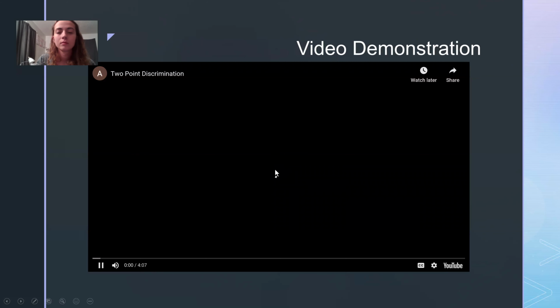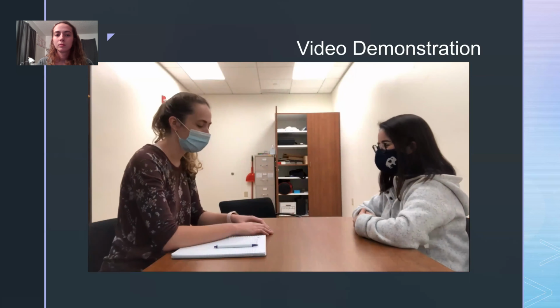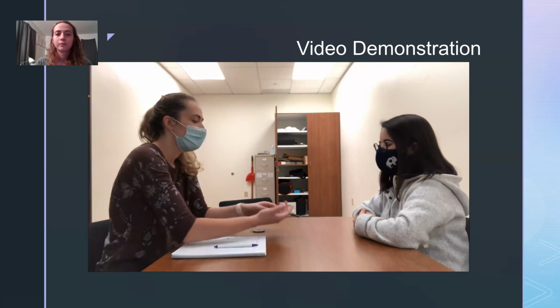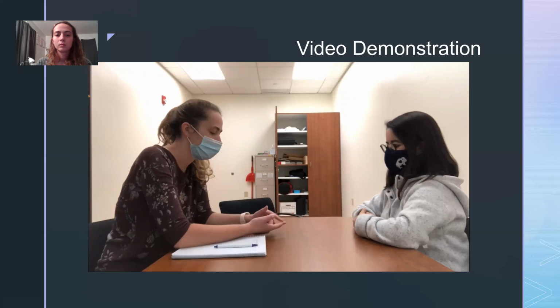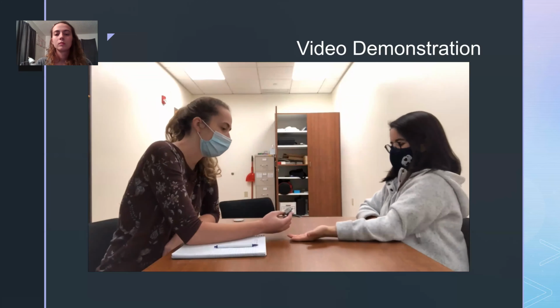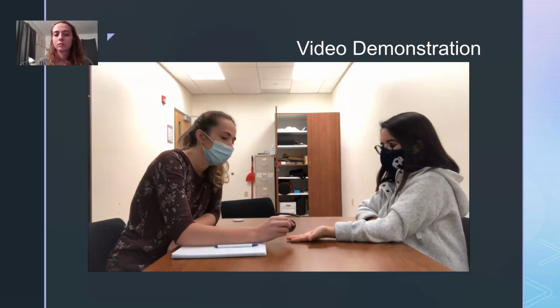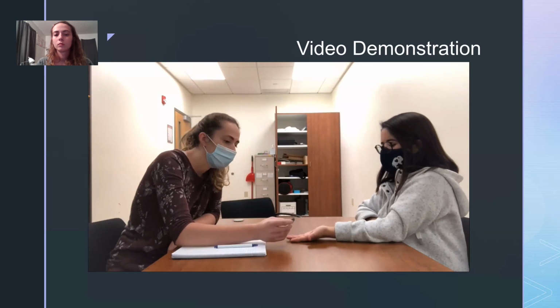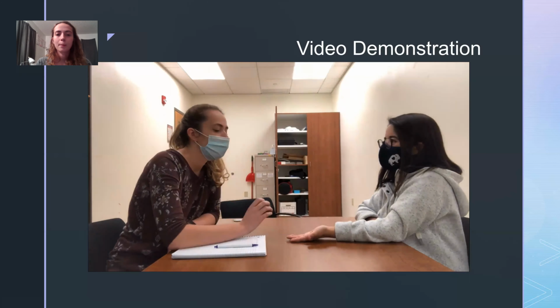Hi, Alina. Hi. Today we're going to be doing the 2-point discrimination test. So this is like a functional sensibility test. So we're just going to differentiate between your ability to feel 1 point and 2 points on your fingertip. So if you could give me your hand that's not experiencing any symptoms, I'm just going to show you how it works. So I'm going to take this tool and I'm either going to poke you with 1 or 2 points, and you're going to tell me if you feel 1, 2, or I don't know, and you'll have your eyes closed. Does that make sense?